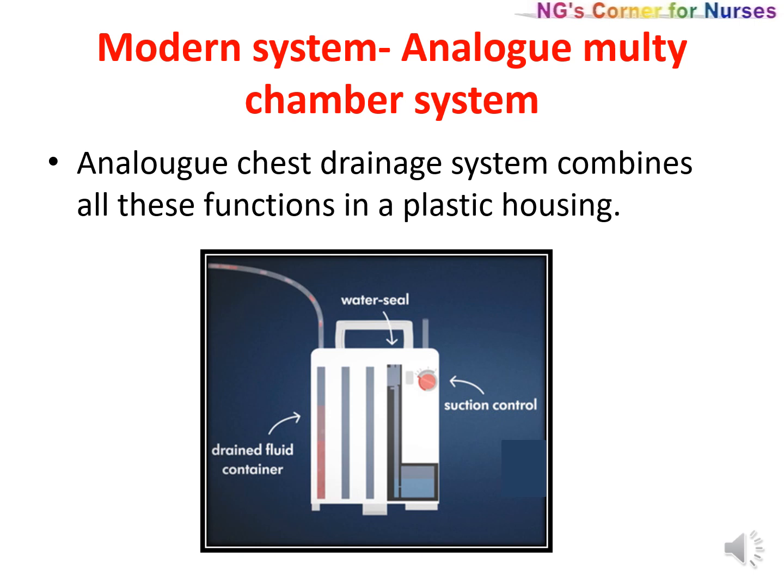Next, coming to the modern system, that is the analog multi-chamber system. Analog chest drainage system combines all these functions that we have already discussed in the last 3 slides all together in a plastic housing.